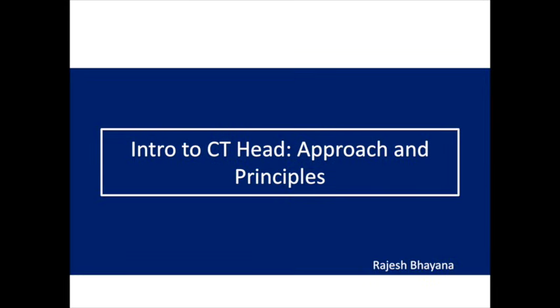Either way, the focus of this talk is the basics, but there will be pearls and some subtlety here, which is going to become must-know for future radiologists. Before we get started, I strongly suggest that you watch the first talk in this series called A Practical Introduction to CT. Many concepts introduced in this talk will build on a basic understanding of what was discussed in the previous talk in more detail.